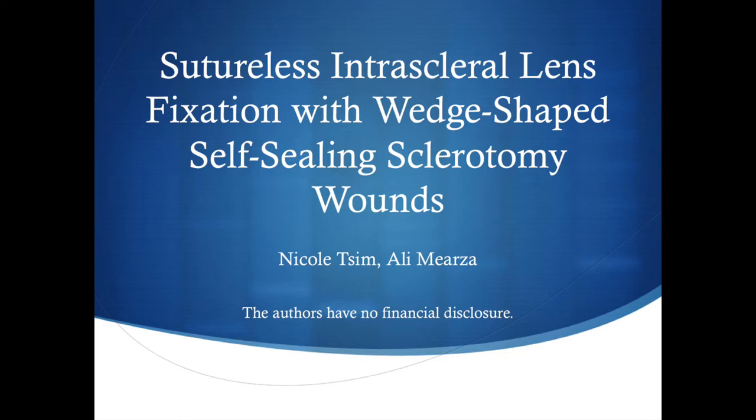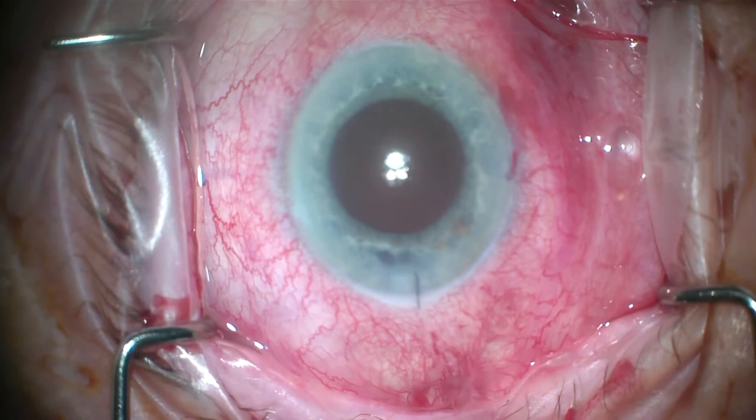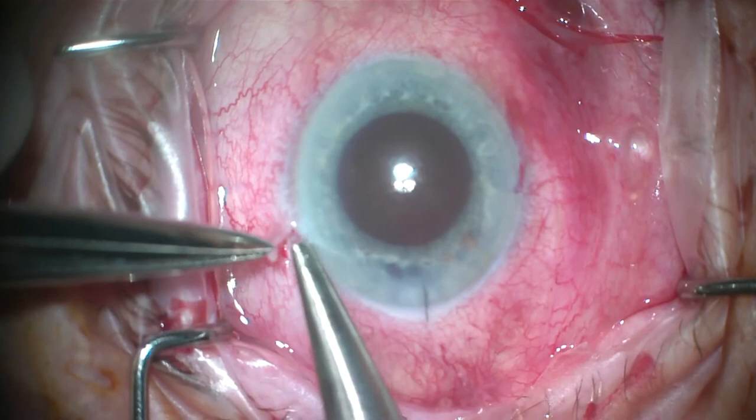This is a video of sutureless intrascleral lens fixation with wedge-shaped self-sealing sclerotomy wounds. This technique was first described by Ernst Jans van Rendsburg in 2019 in the Journal of Cataract and Refractive Surgery, describing a technique for patients with insufficient capsular support requiring a posterior chamber intraocular lens fixated to the sclera.